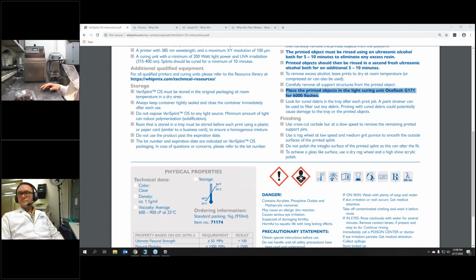You have to. I know a lot of people like to play with the settings because they think it gets less, I mean, because they see that it gets less yellowing. But remember, you're putting a patient at harm at that point, and that's the last thing we want to do.